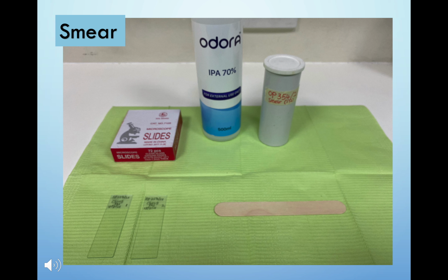So these are the materials that need to be prepared before a smear can be done. First of all, we need to have microscope slides as shown in the picture with patient's name and date label. Also we need to have a tongue depressor. And then we need to have a fixative solution, which is alcohol 70%.